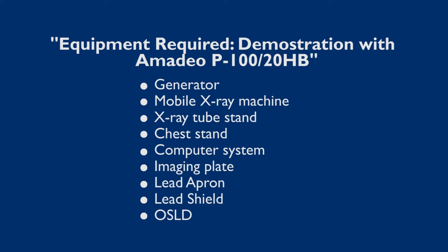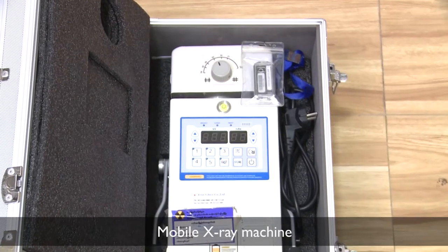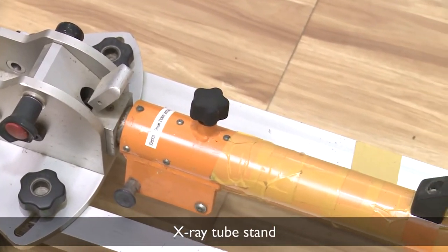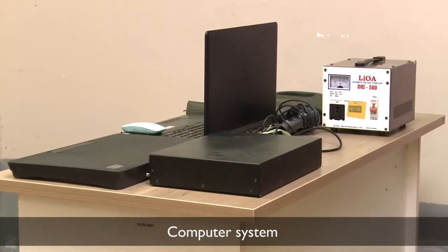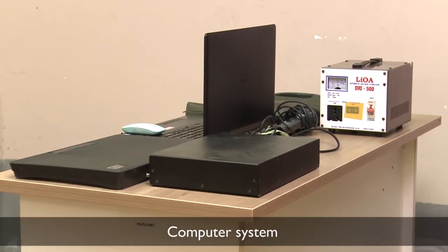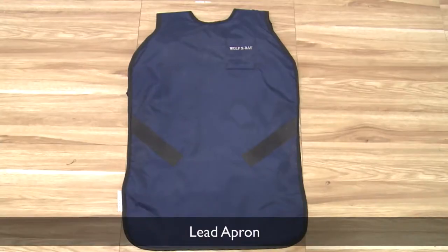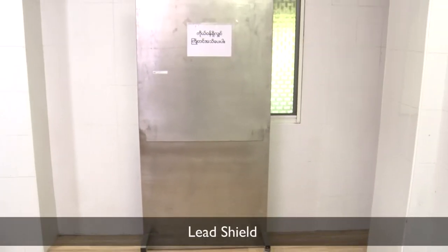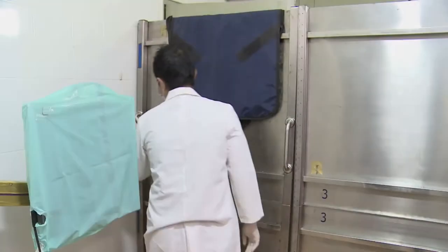First, the equipment required includes: generator, mobile x-ray machine, x-ray tube stand, chest stand, computer system, imaging plate, lead apron, lead shield, and optically stimulated luminescence dosimeter (OSLD).